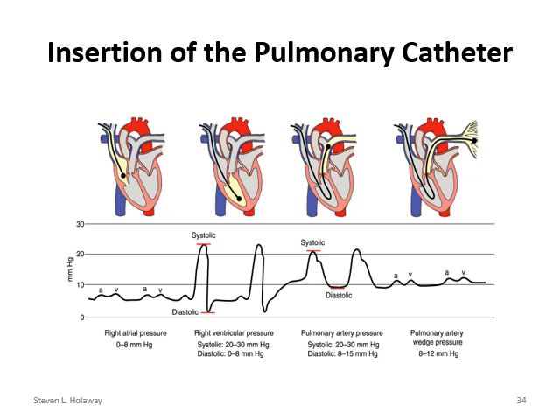As they get the catheter in, they're watching for waveforms. You can see the waveforms. Once they get into the right atrium and see these waveforms in the right atrium, they will inflate the balloon. By inflating the balloon, it allows the blood flow to actually help pull the catheter through and direct it in the right directions. So they're watching for the waveforms. Once they enter the right ventricle, you can see the changes in the waveforms. The waveform gets much larger, so we see a change in the pressure. They continue to monitor it, and then they'll see the change in the waveform.